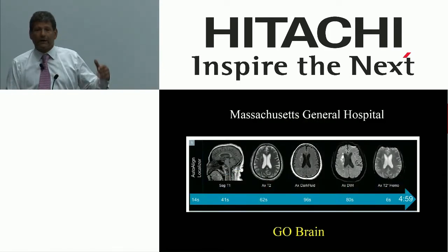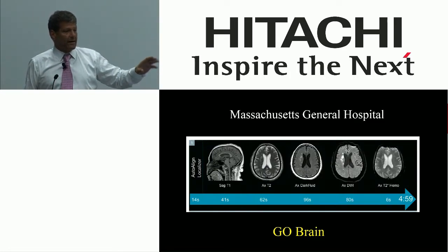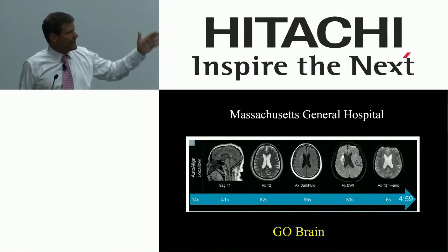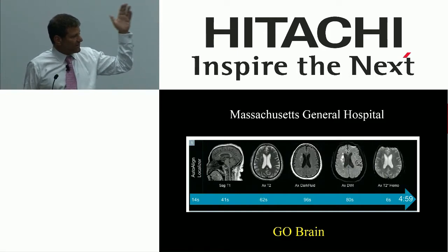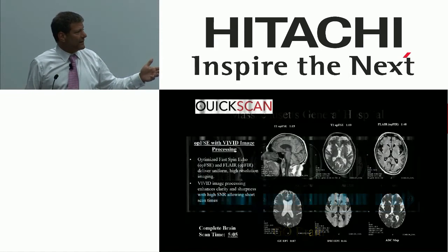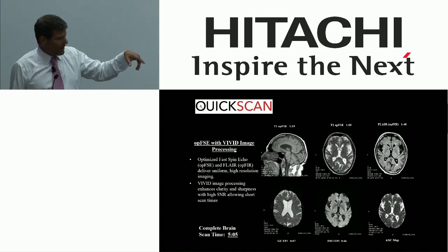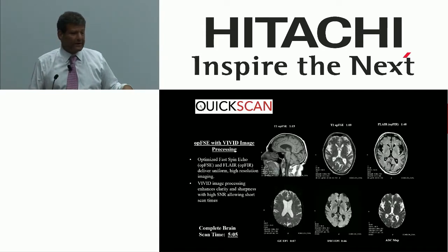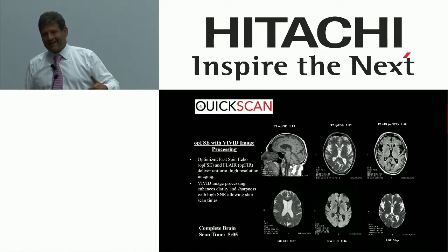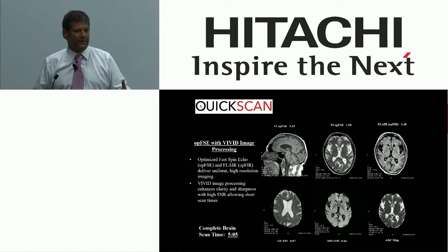Now, I said, more is not necessarily better. There's data now in almost every corner that a 5-minute brain exam, you've seen this. This is something that Siemens pushes, but frankly, they did the work at Mass General, and they say 5 minutes is all we need for an acute brain. We're not going to miss anything. Here you see the same approach on the Hitachi Oasis. Really the same types of sequences you'd expect to see. Basically a 5-minute exam time. The difference here is one's been validated against clinical outcome, but it shows the patterns, the things you need to produce to make a difference.